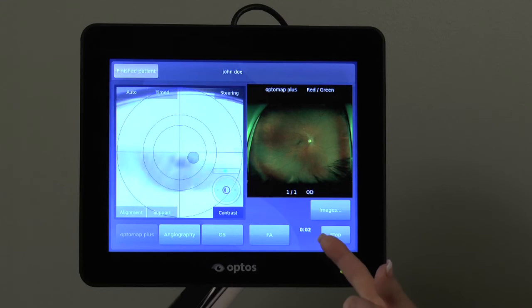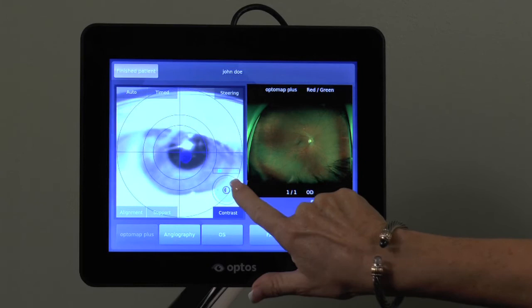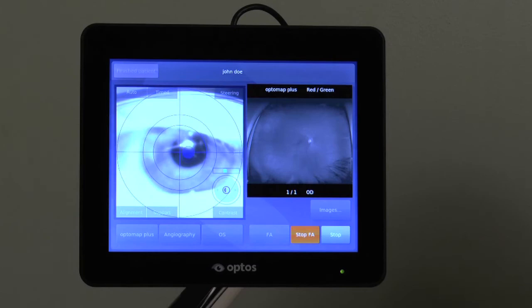Image contrast may be decreased or increased by using the slider button at any time during the study. It may be necessary to increase contrast at the beginning of the procedure and decrease once the dye shows up in the image. When the study is complete, select Stop and confirm by pressing the Stop FA or ICG button.